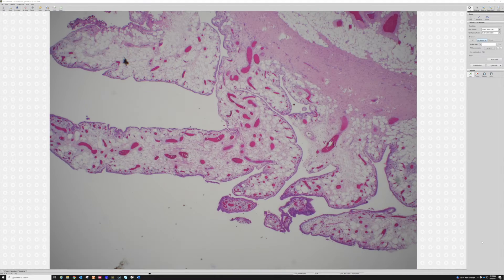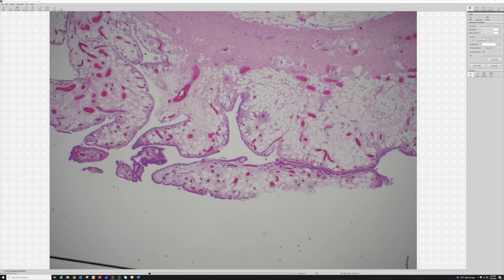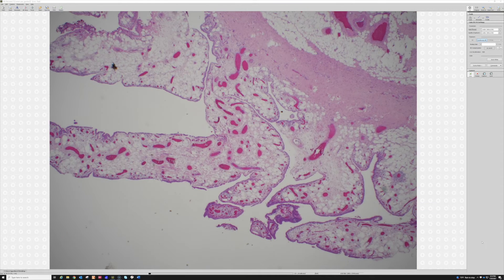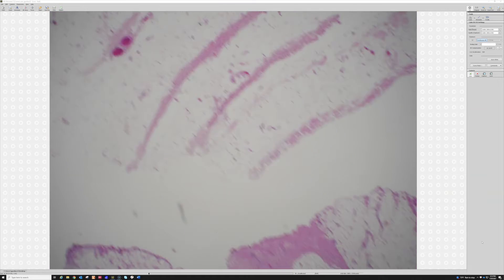Here's another piece from the same case, just to show the polypoid configuration again. When you see polypoid projections of synovium without a bunch of fat in them, you can also think of papillary synovial hyperplasia — reactive hyperplasia of the synovium, as seen around osteoarthritis or other reactive conditions. You sometimes see polypoid projections that are just a reactive process.